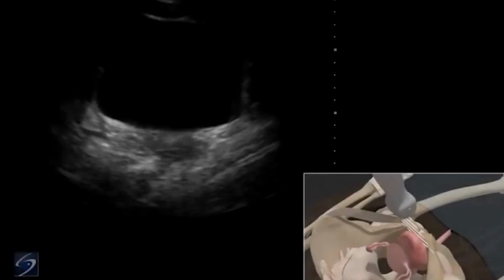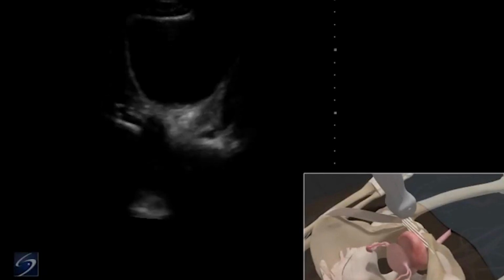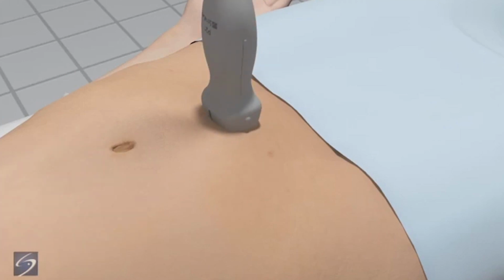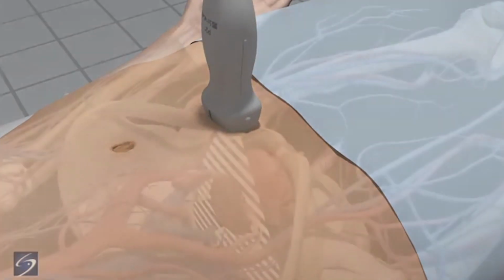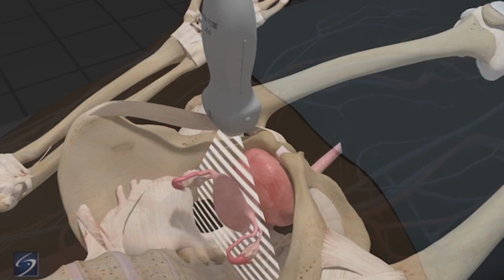A phased array transducer with an abdomen exam type is used to perform the pelvis view of the FAST exam. Place the transducer in a transverse position with the orientation marker to the right at the level of the symphysis pubis. The pelvis is evaluated in 2 planes. It is easier to perform this exam when the bladder is filled. The bladder is used as an acoustic window to view the cul-de-sac or retrovesicular space for free fluid.